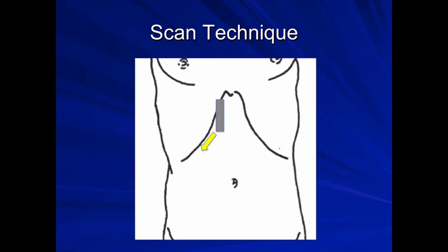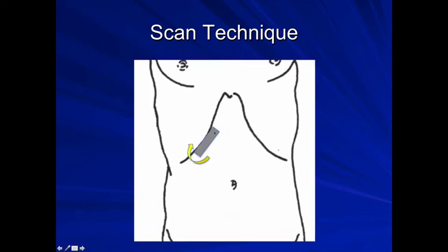the gallbladder. We will then also rotate our probe so it's parallel with the costal margin, and then we tilt the probe up underneath the costal margin and sweep back and forward on the underside of the liver until we find the gallbladder. If we are having difficulty, and we'll often find this in people whose liver sits very high up, then it's quite useful to bring the probe across here, parallel with the ribs, and fan through that window to see if we can see the gallbladder.